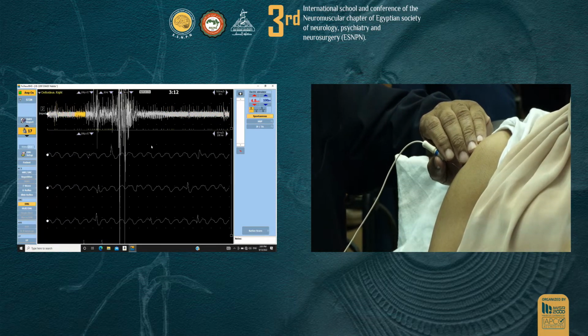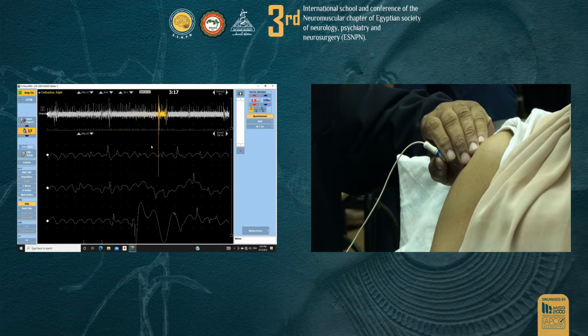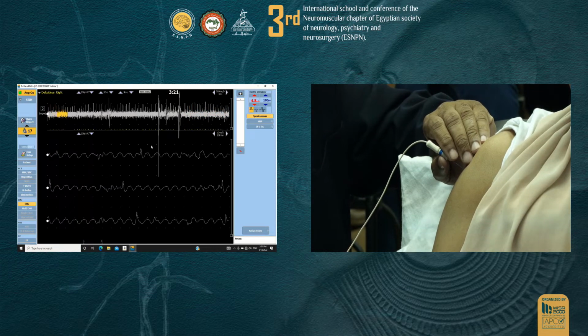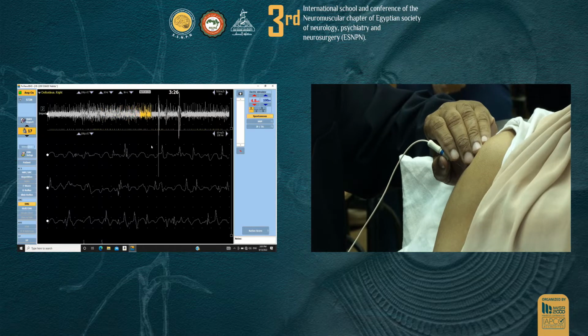What can we do to get rid of this? Usually the baseline is flat, huh? Yes, that's right. Or another ground. First, another ground. Let me give another ground before I take out the needle. Can you stop it? How do you stop it?